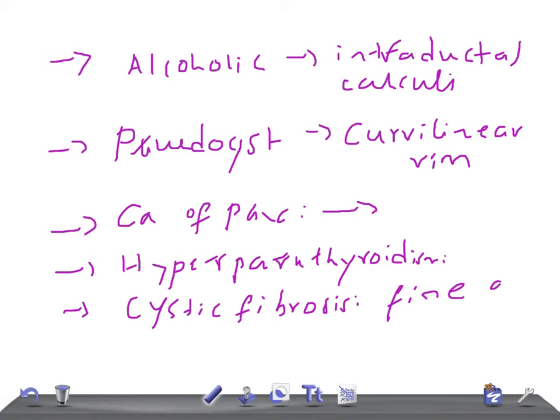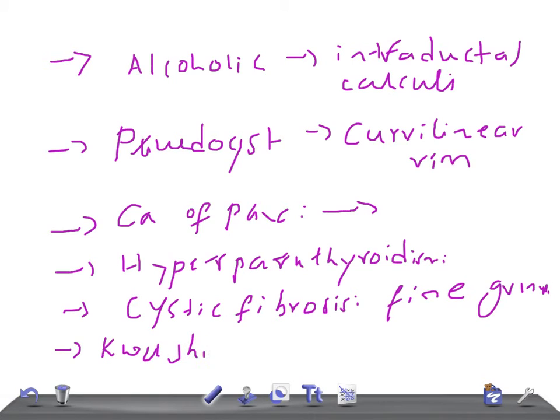Then we have other causes like kwashiorkor. Pancreatic lithiasis is a frequent finding in these patients. The pattern of calcification seen in kwashiorkor is similar to chronic pancreatitis.